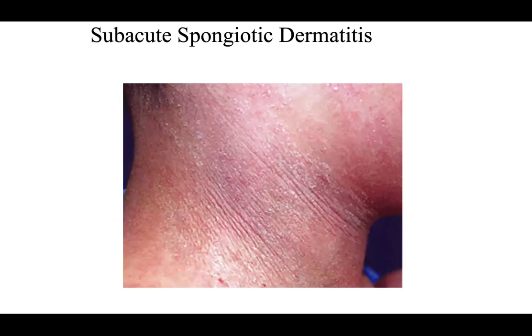So clinically, you'll see these scaly, erythematous, eczematous looking plaques, papules that coalesce into plaques. This is just a really undifferentiated rash most often that we need biopsies to demonstrate. Are we dealing with a subacute? Are we dealing with some type of interface?